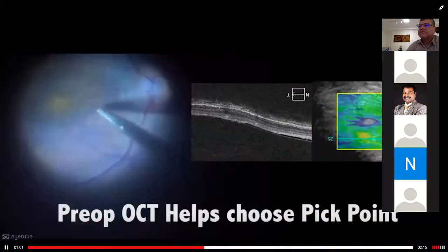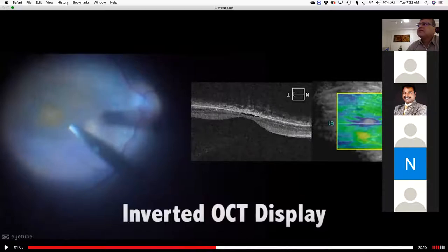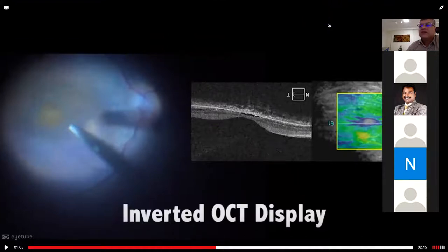Removing the epiretinal membrane — preoperative OCT helps to see the macular adhesions. I'm grabbing the internal limiting membrane again. Let me check my connection. Can you see me? Can you hear me? It's okay here.